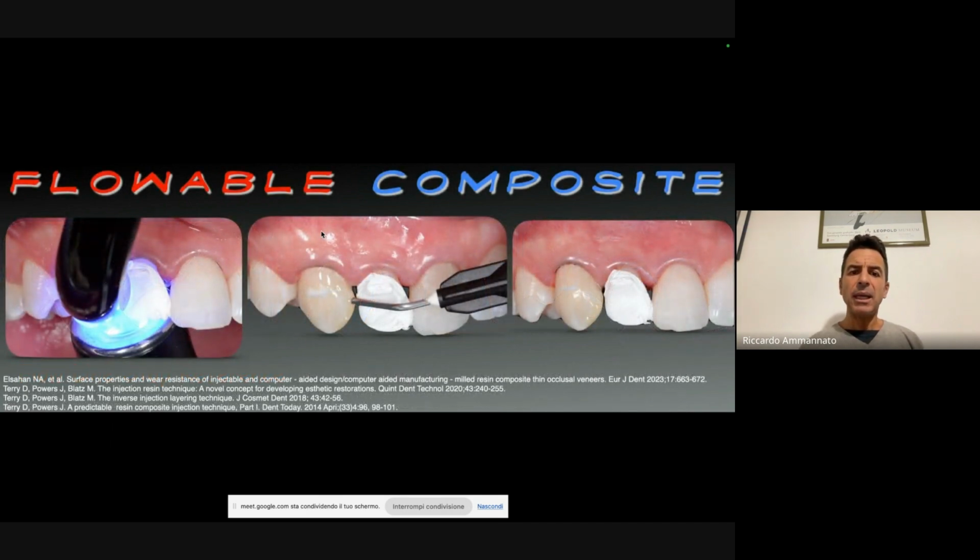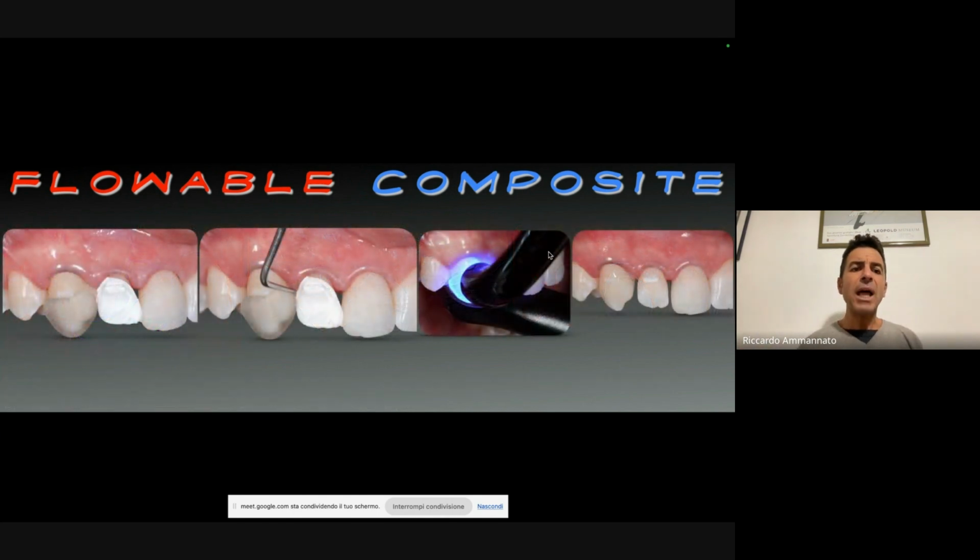I'm curing the bonding, and here I'm placing, instead of a packable composite, the flowable, okay? I place the flowable composite on the tooth. I'm not going through the index, so I do this variation of the flow injection, and I place it on the tooth, because for me, I have fewer bubbles. And then I land with my 3D printed index, and you see here in this first image, I have some excess. Since it's a single one, before curing, I can remove this excess material with a scaler, with a probe, with whatever you want.